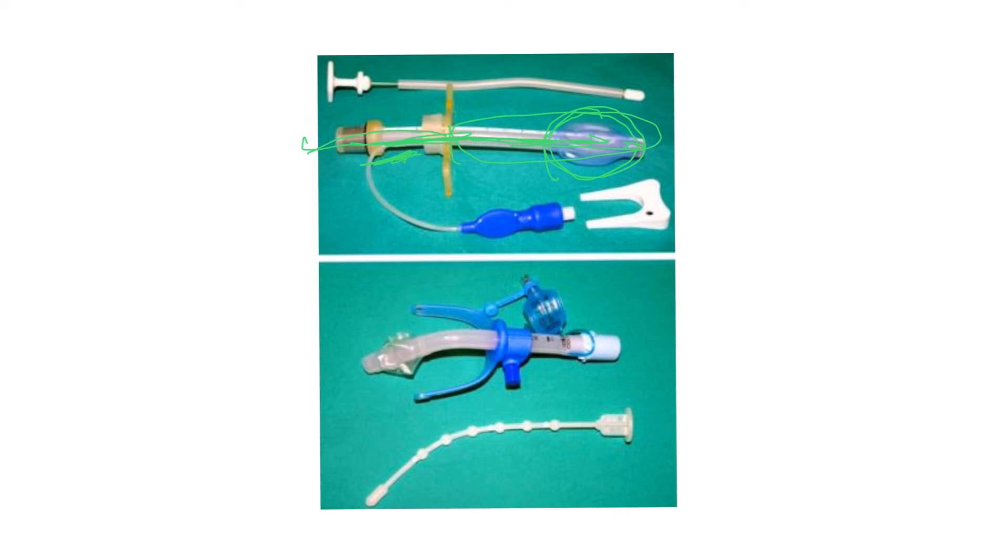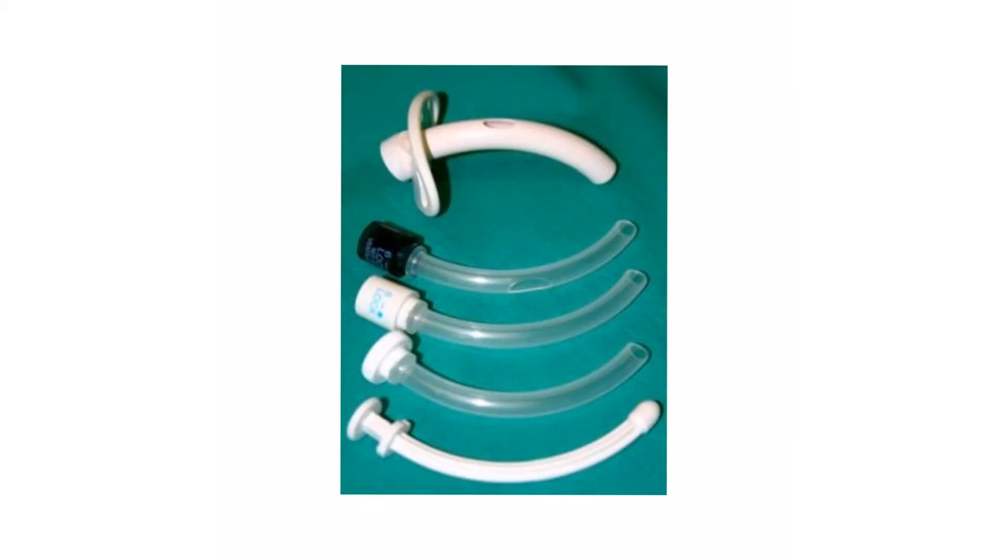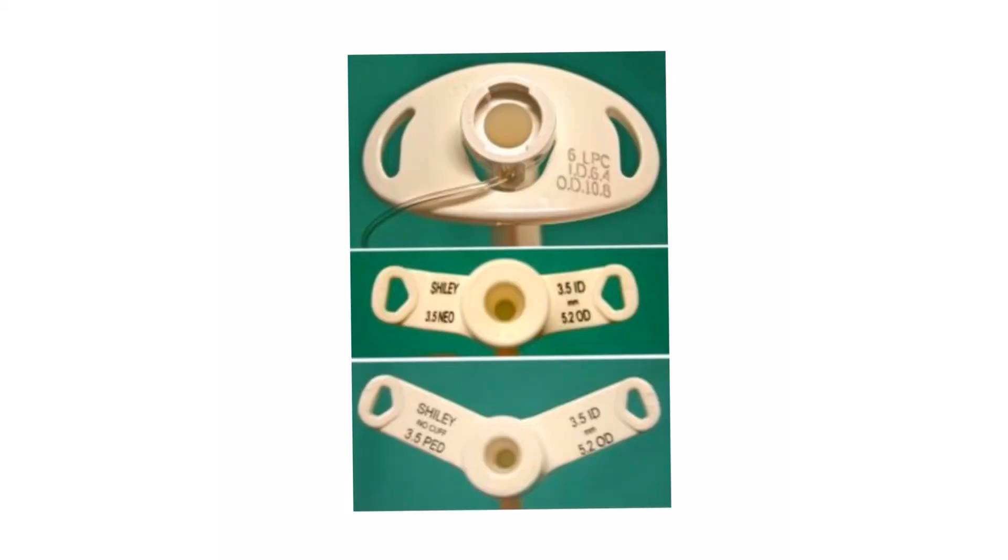That's part of the general care to continue to have suction periodically to prevent such catastrophic complications. This is another type which is fenestrated. You see this opening here. This is mainly used for somebody who's not on mechanical ventilation and in the process of weaning him off the tracheostomy tube.